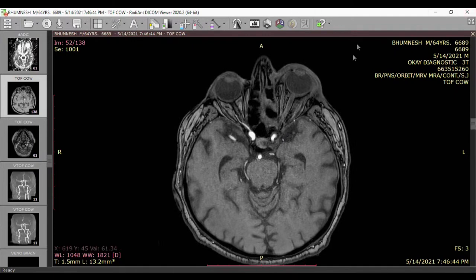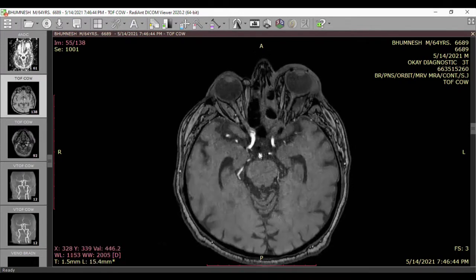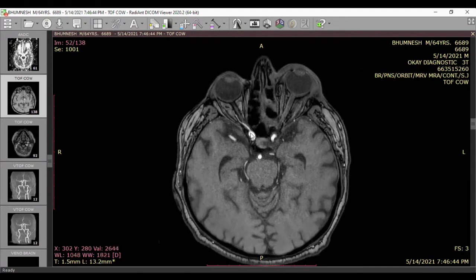See this patient, absolutely normal eyes on appearance, hardly any paranasal sinus disease. This patient had presented with vision loss, mucormycosis, vision loss. And see what we observed. This is MR angiogram. This is carotid artery. Can you see the ophthalmic artery?